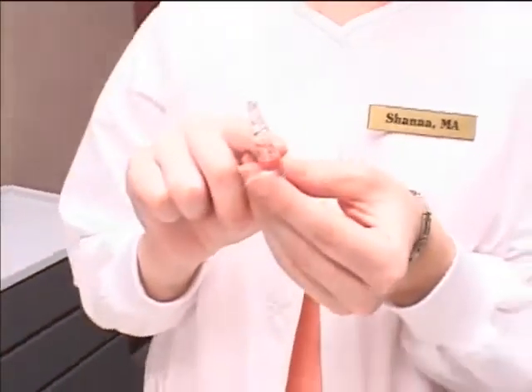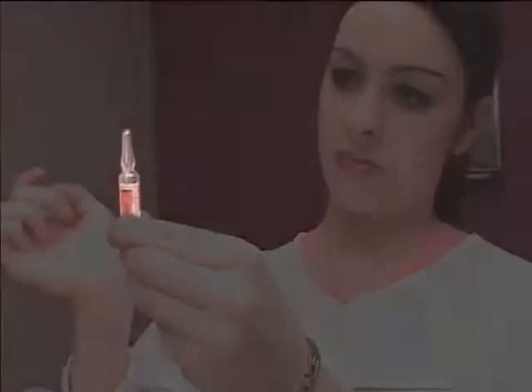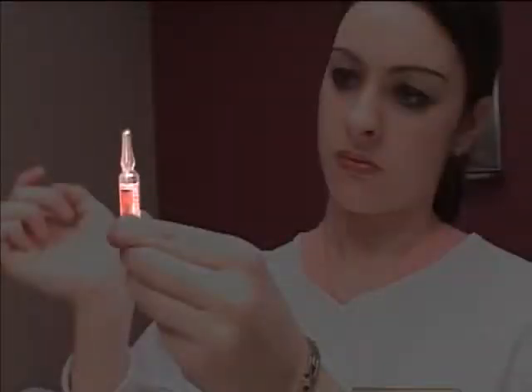Check the ampule for the location of the medication. If the medication is trapped in the top of the ampule, flick the neck repeatedly with your fingernail while holding the ampule upright to move the medication into the body.